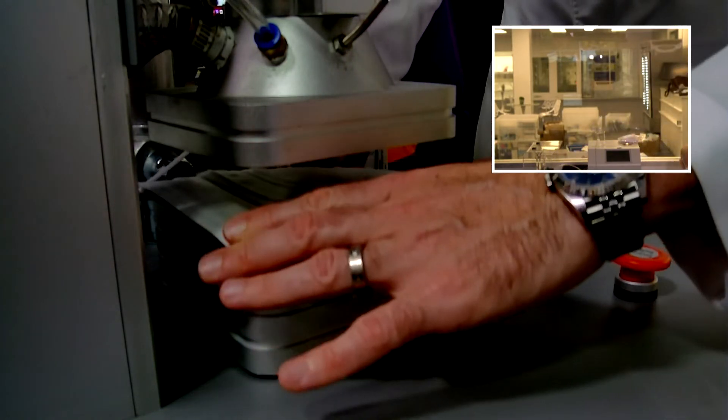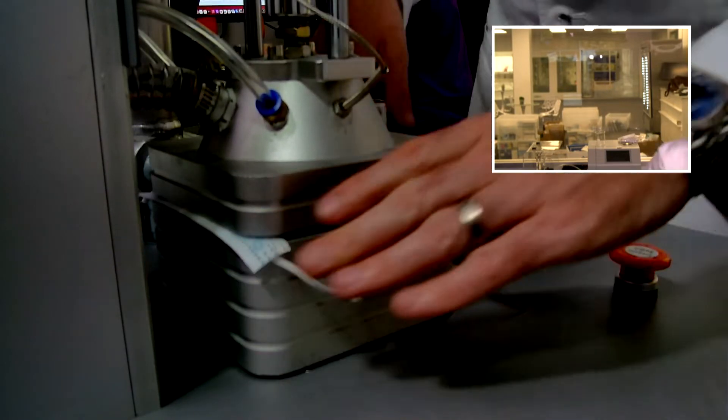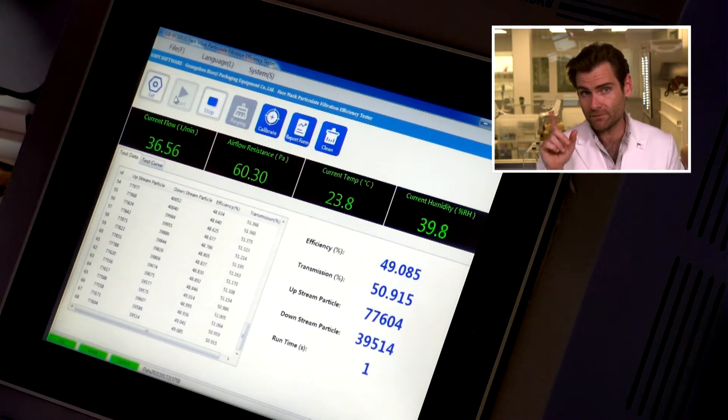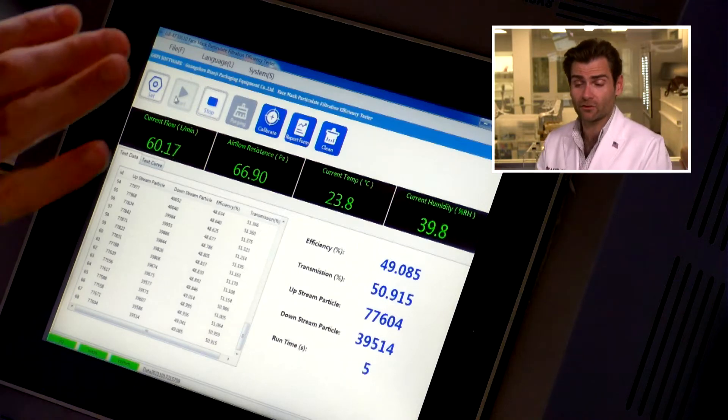I swear it's called Winners — I didn't make that up. I wish I did. That's a good clamp right there. Let it rip. This is a PFE machine — Particulate Filtration Efficiency Machine. If you want to find out more about how this works, check out that link. But we are doing the surgical mask test here.